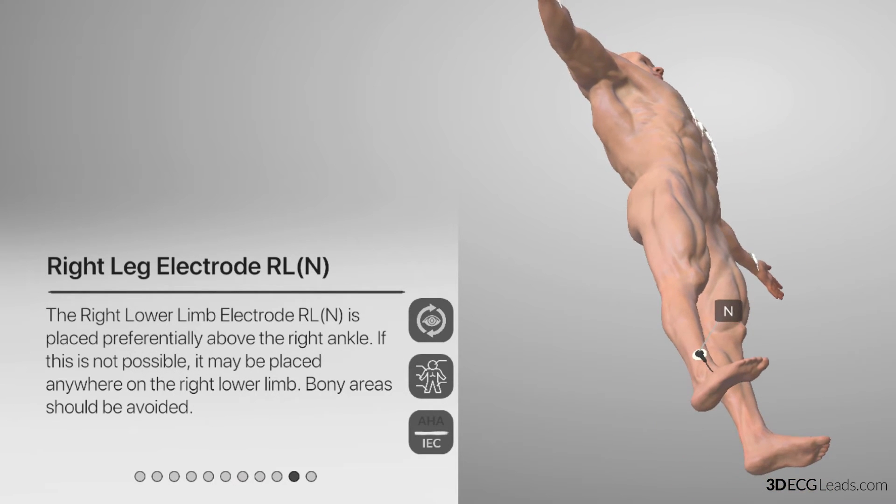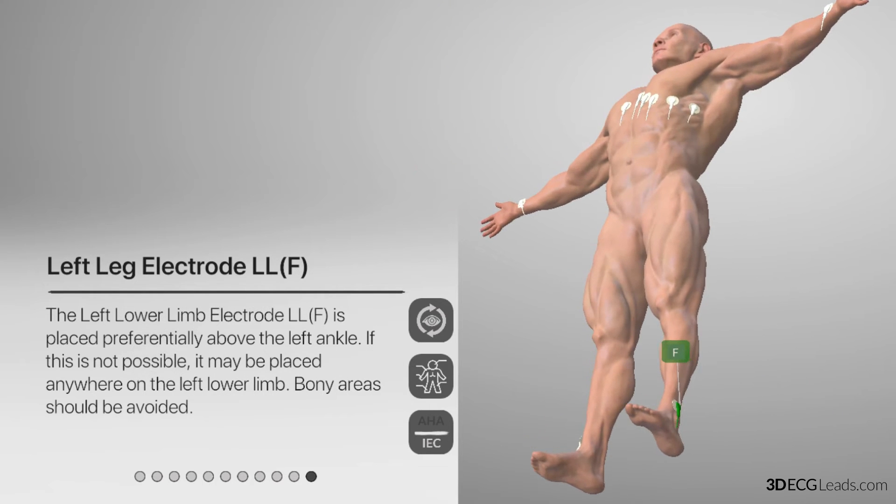Down to the right leg lead, it is named N, and is black instead of green. And lastly, the left leg lead is named F, and is green instead of red.